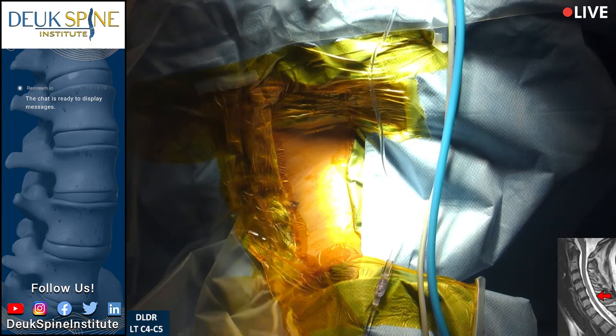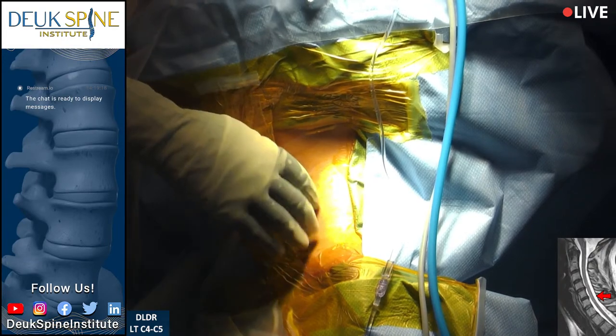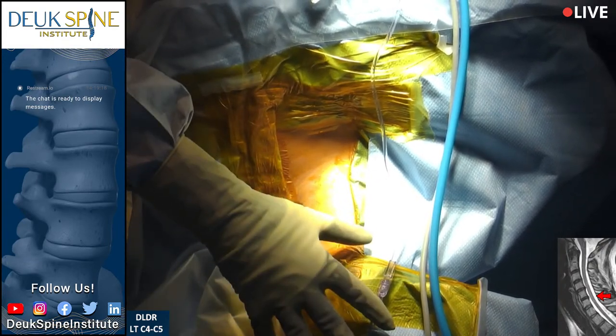She has symptoms more to the right side, so we're going to go in on the left to reach over and make sure we get the right side. Our patient is asleep, and she has her face here.